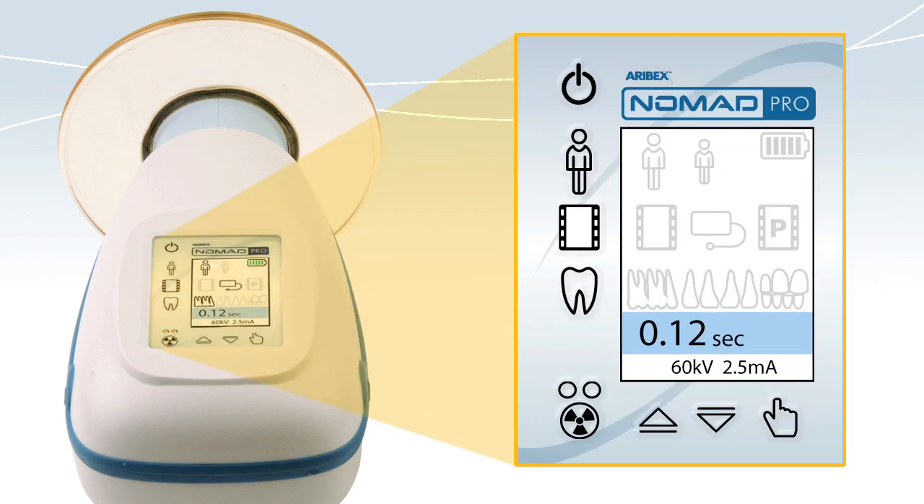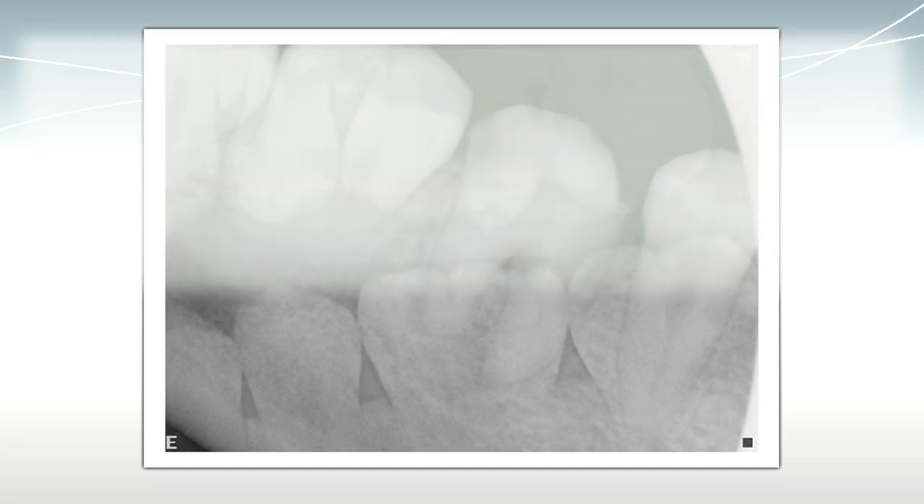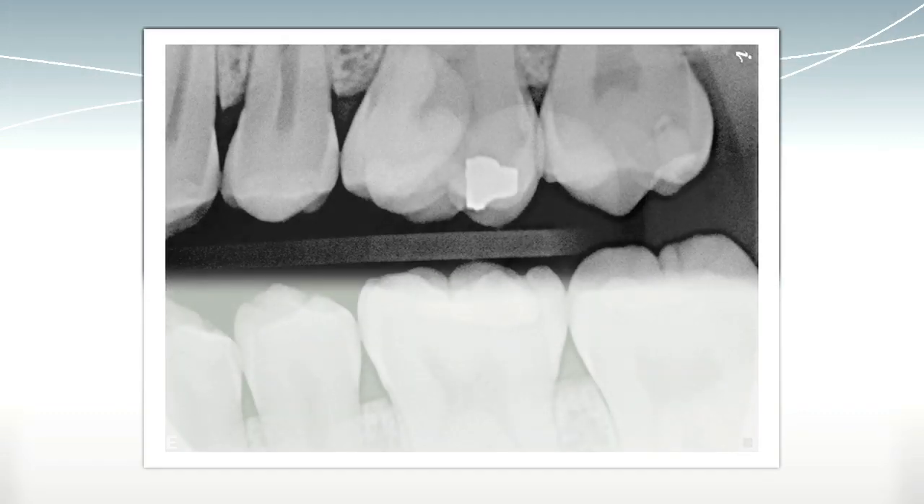Nomad Pro's control panel is easy to use. In the upper right is the battery indicator. On the left are adjustments for adult or child patients, film, digital sensors or phosphor plate receptors, and anterior, posterior, or bite-wing views. The exposure time is preset, but it can also be adjusted and saved manually.